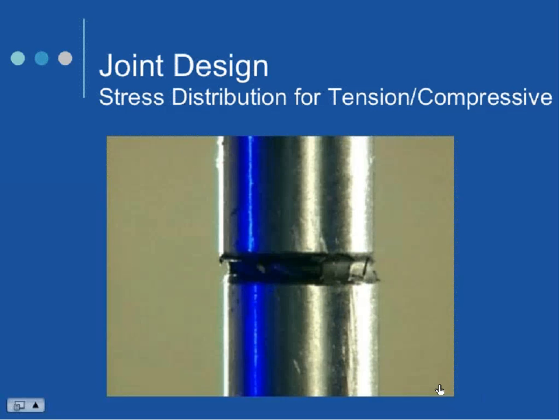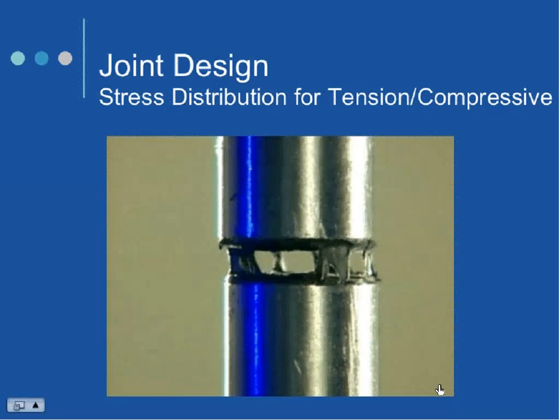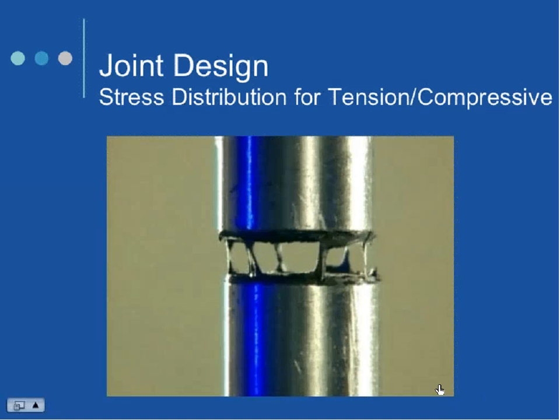You see how that's pulling nice and evenly? This is going to actually be what we call cohesive failure, just to give you a sense of what that is. Not something we ever really want to see in a medical device, but sometimes that's desirable if you're doing a gasketing application, again, on the industrial side, with silicones that don't have a lot of integrity or cohesive strength. But you see there's not really any particular point, it's not cocked or turned any particular way, where the stress is greater, right?